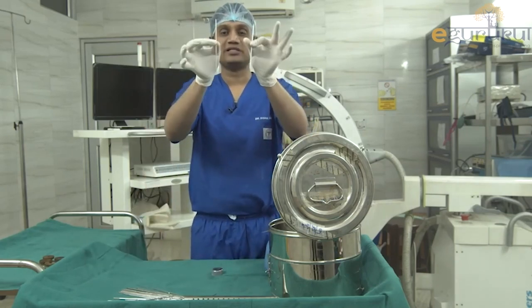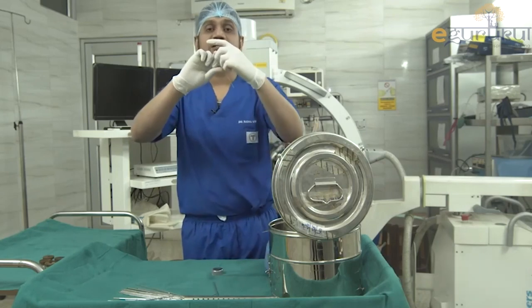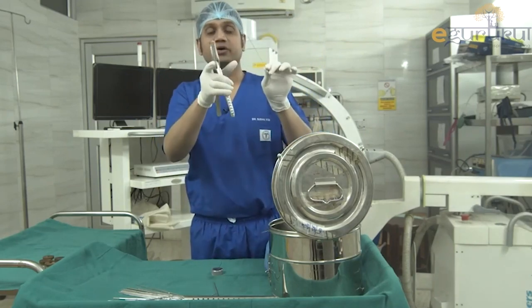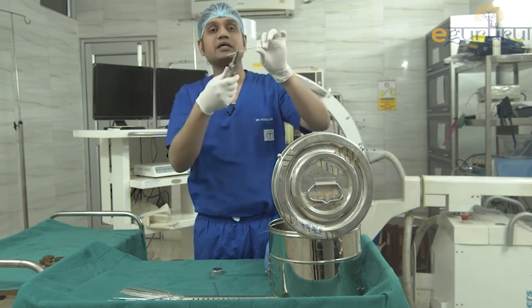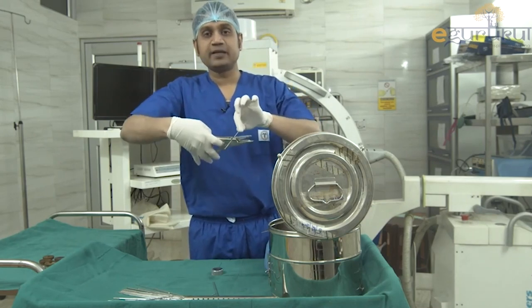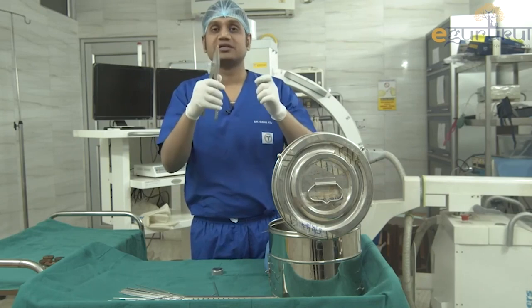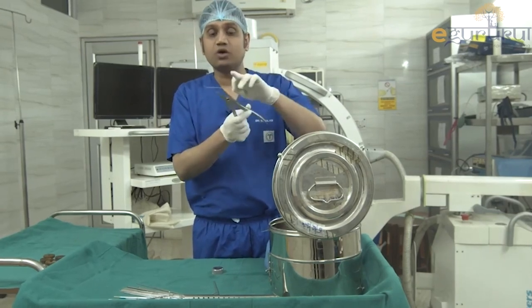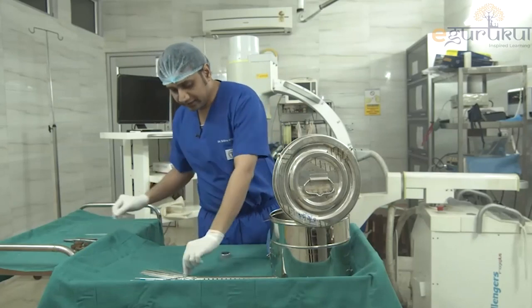K-wires vary in thickness from 0.5 mm to 3 mm. When one end is inserted into the bone, the other sharp end remains exposed and can cause injury. For this, we have a plier: you can pass the wire through its hole and bend it, or use the slot to cut the K-wire and mold it to whichever side you want. The plier is used to cut or bend K-wires.